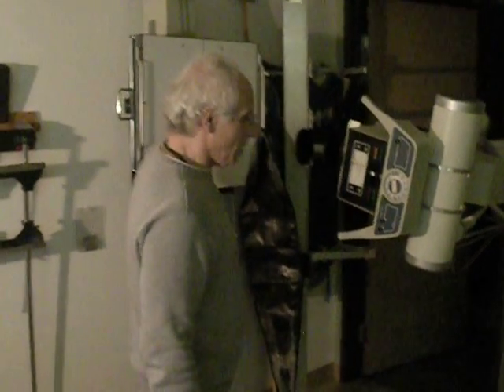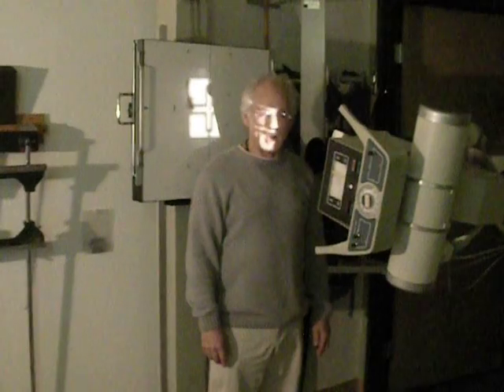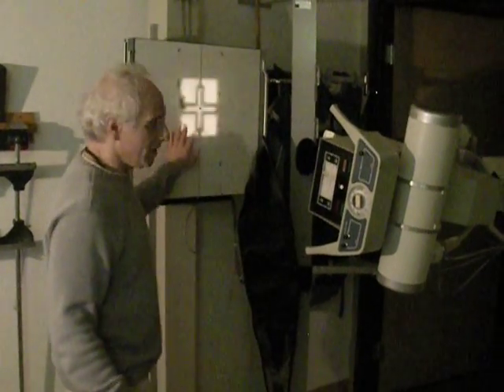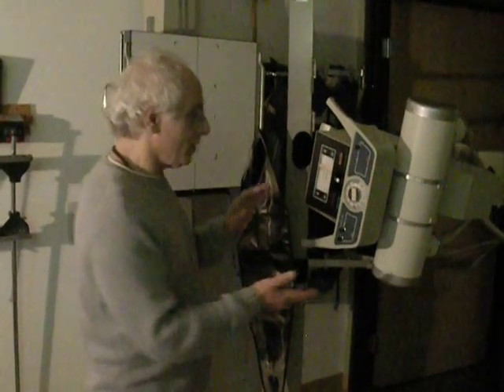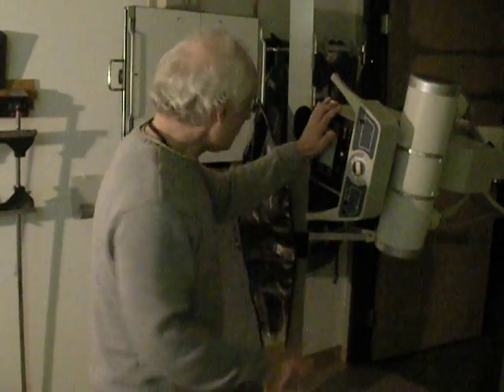And I'm placing a right marker here because I know this patient is going to be sitting, standing, facing this direction, and this will be the patient's right side, and I can leave that marker there for the AP and for the open mouth.